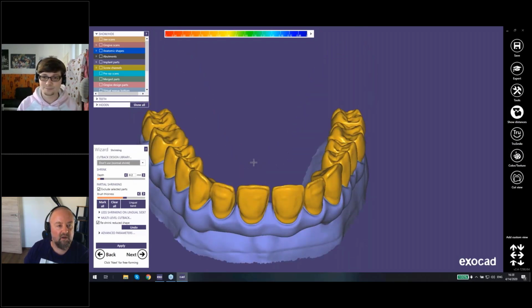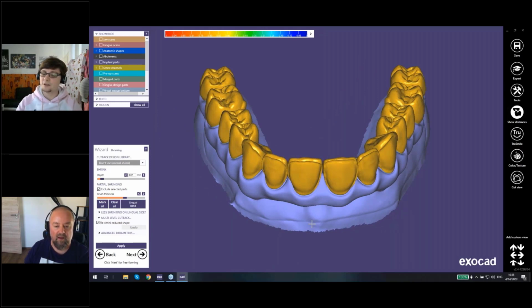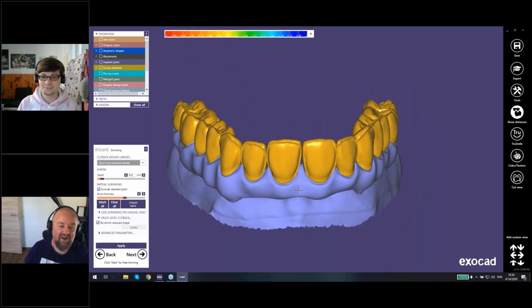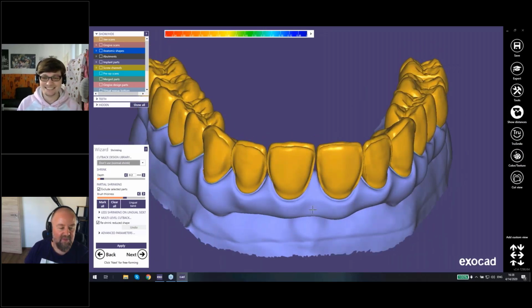Yeah. I'd like to come back to a question we already discussed before. Maybe something was not clear. It looks like the question was about pressed crowns, if it's possible to choose a pressed crown or to define a pressed crown on a thimble. To be honest, I never actually tried that. It might be possible. I cannot answer this question right now. I think we should get back per email for this. Yeah, that's a really good point. To be honest, I was hoping that you'd be able to answer, because I don't know that either.